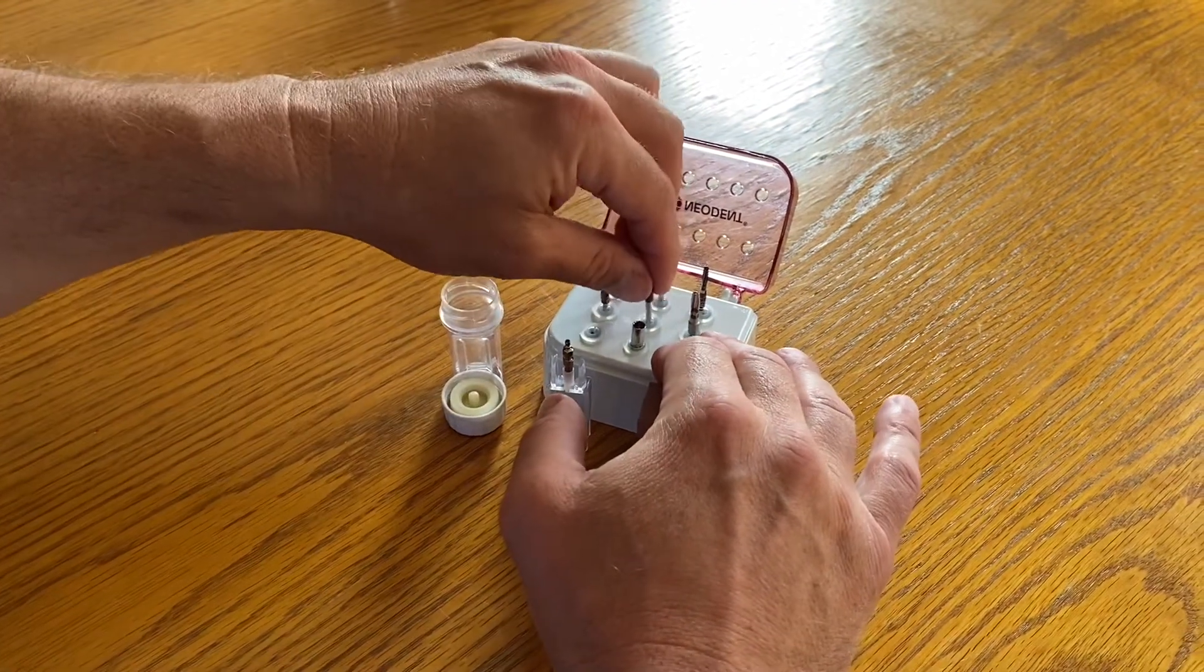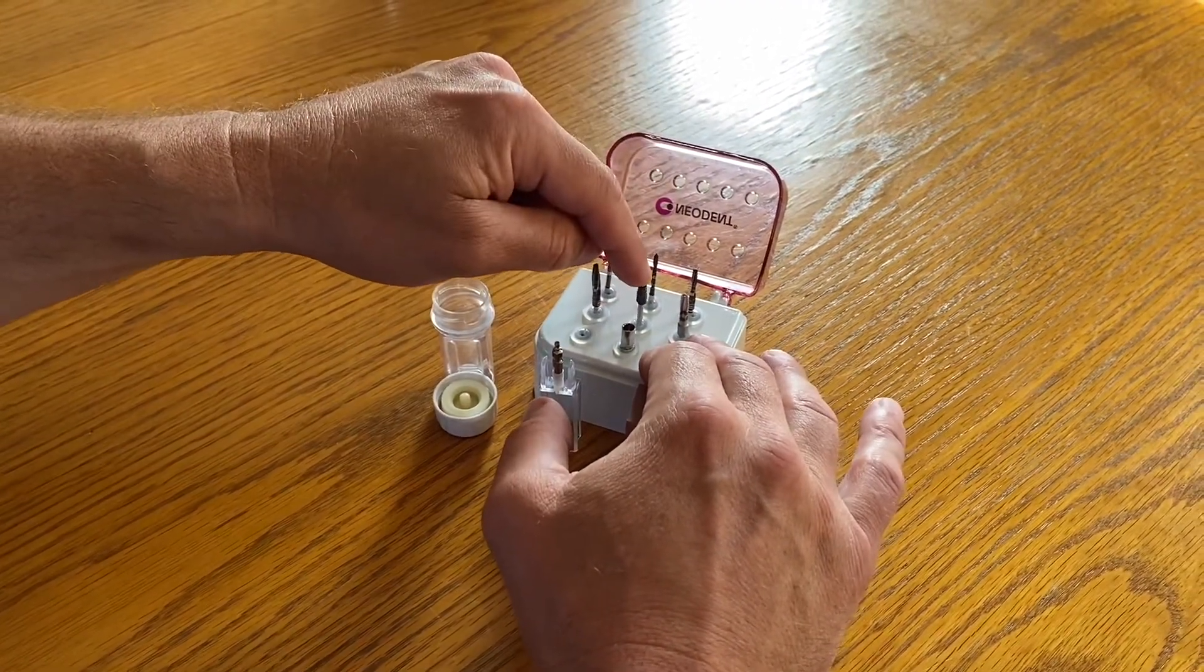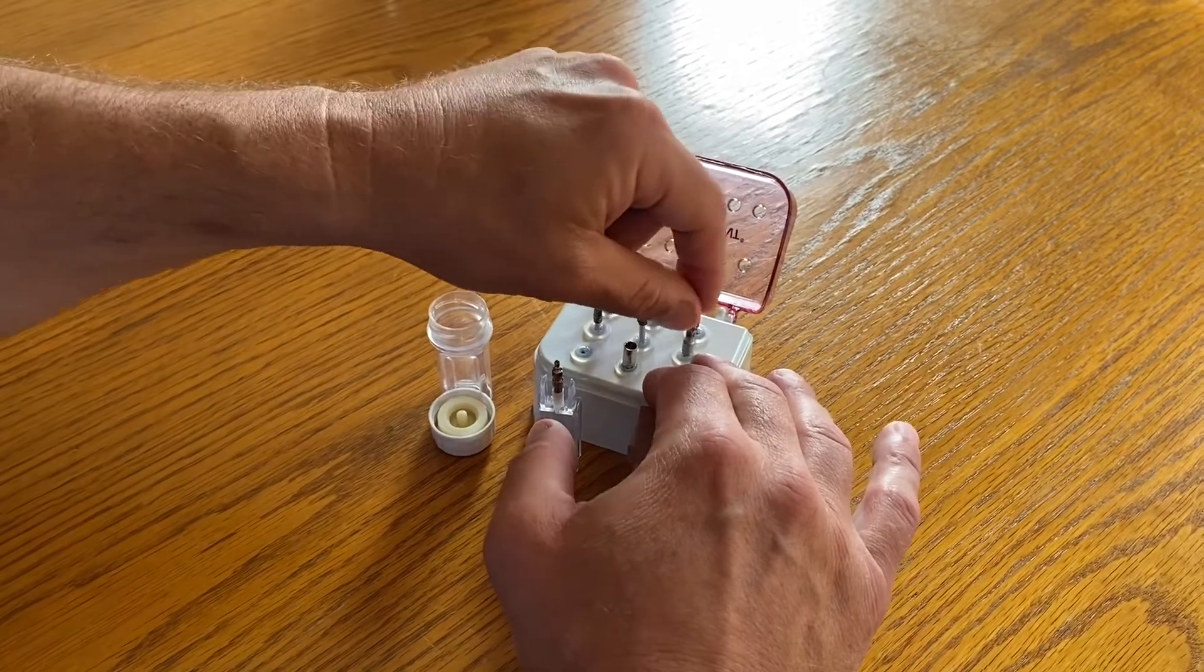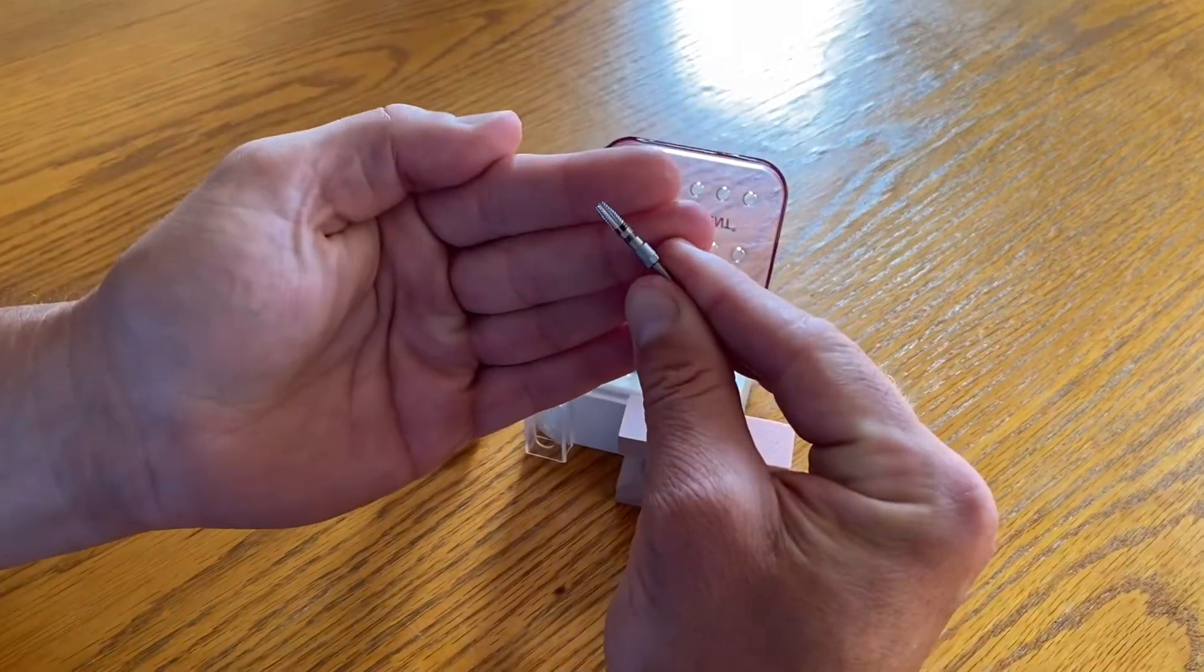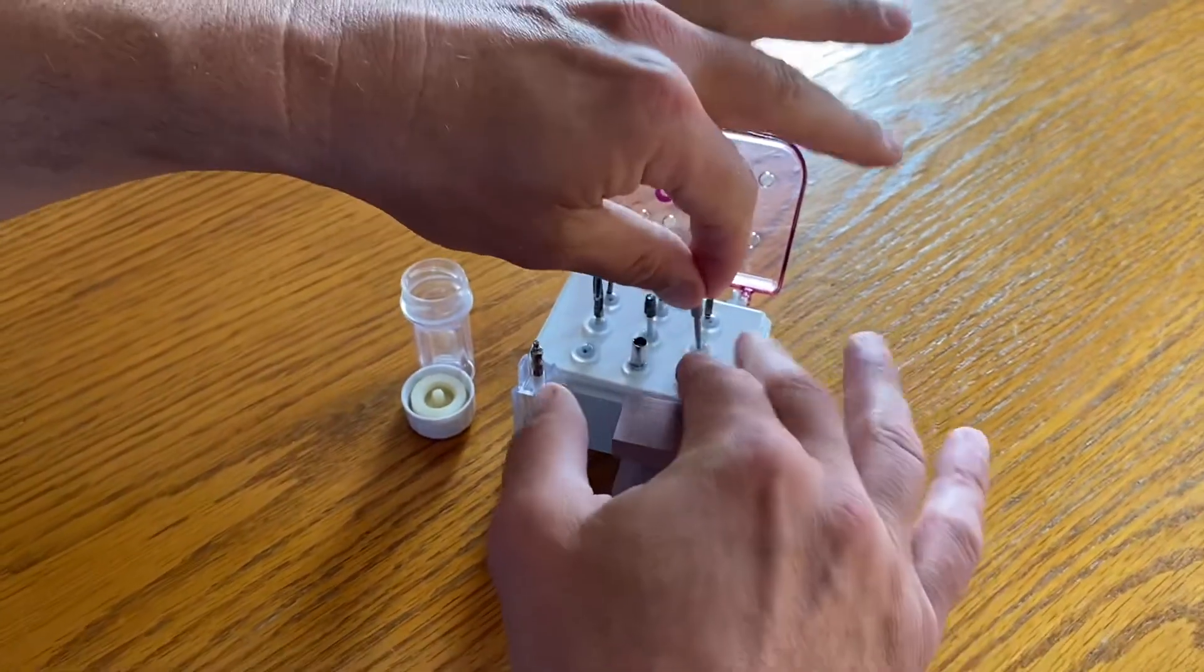And then we also have the 4.3 if we need to prepare it more. There's a counter bore or counter sink to take away a little bit of bone at the top, and we even have a bone tap to thread the walls.